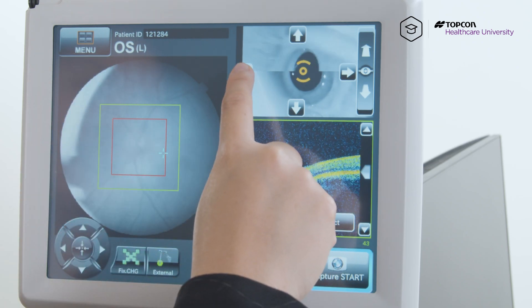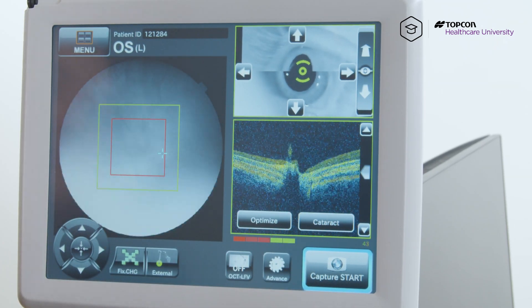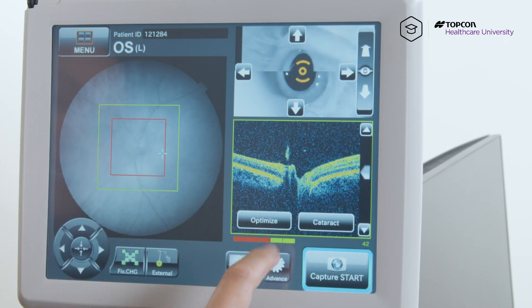To get rid of any crescent, just chase the crescent away, holding down that arrow in the direction that you have it. Once you move the optic disc, hit optimize.